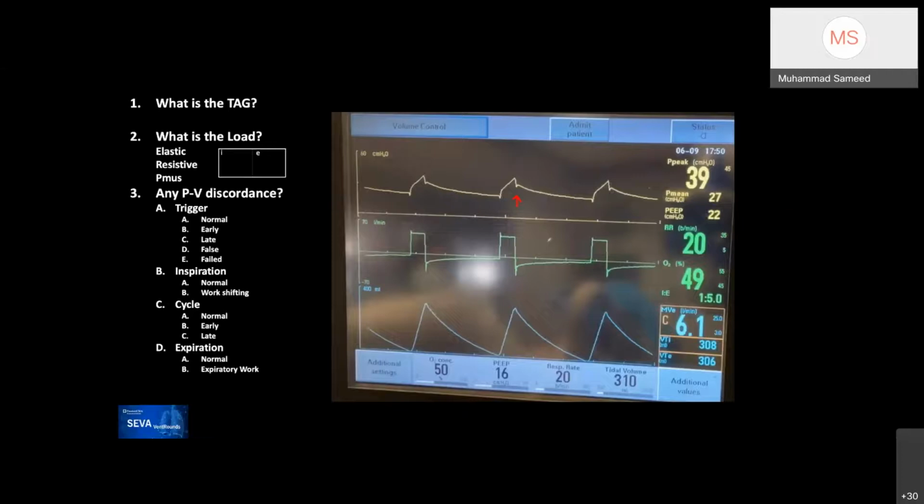That's a good observation. This is fantastic. The first time we've seen this particular situation, right, Matt? Yeah, so I'll talk you through the steps here, and then I'll tell you what this case was, because it was very interesting. I saw that once in the bronch suite when we were trying to stent someone with extensive disease, so that reminds me of something occluding the airway or something like that. But it'll be interesting to see what you find out in the ICU.